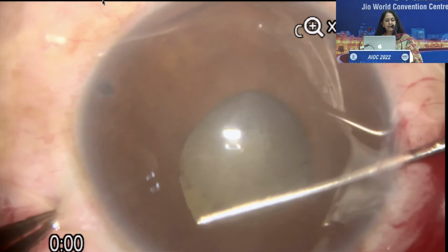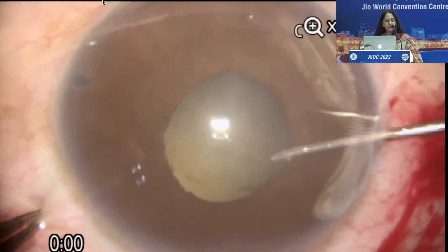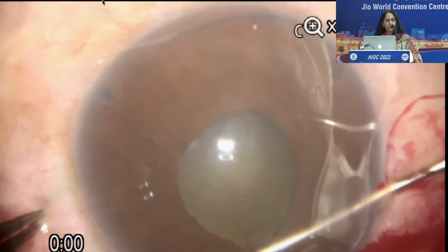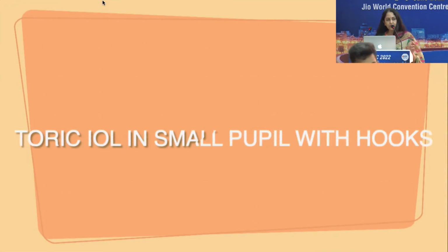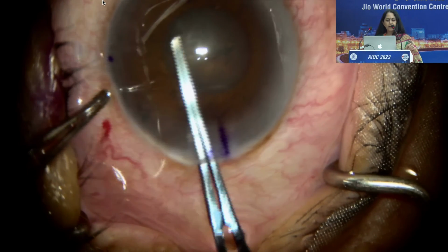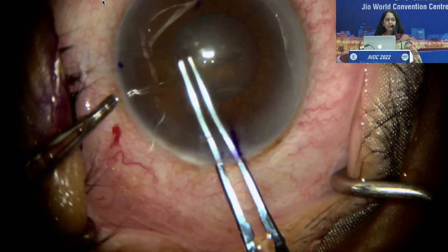This is another case where the pupil is stuck and there is a posterior synechia. So with a Lester's hook, after putting in a good OVD, you should not compromise on the OVD in these cases. You just need to open up this pupil. This is a case where a toric IOL was required. And as I said, it's very important in a toric IOL that we check the axis.